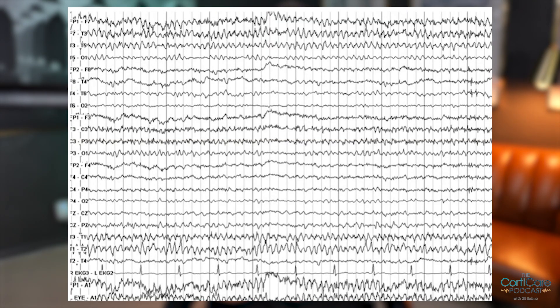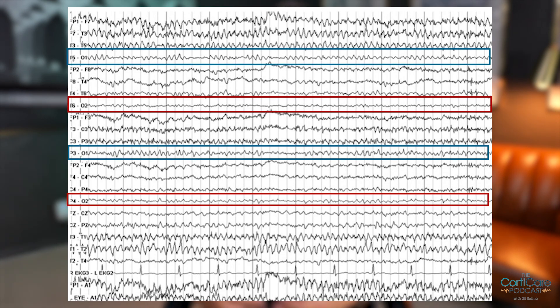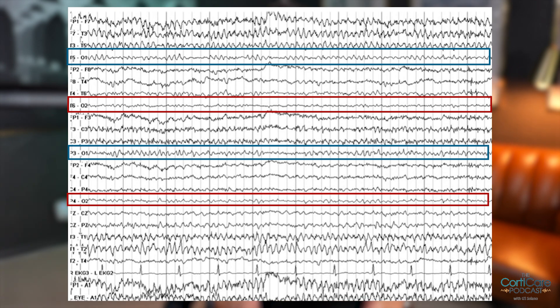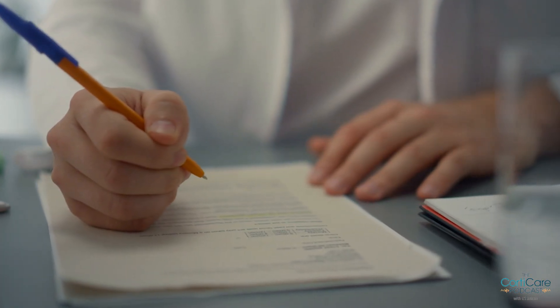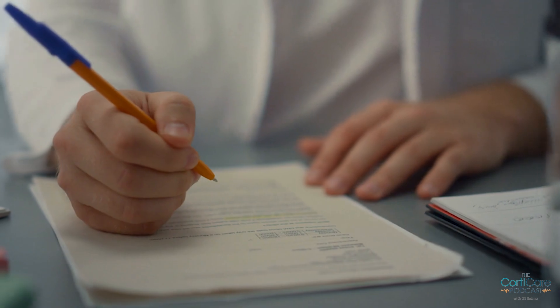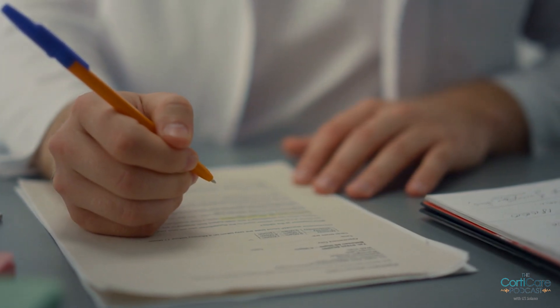Here's an example of alpha asymmetry where the rhythm is slower over the right hemisphere in a patient who has suffered from an acute right frontoparietal ischemic infarction. This type of alpha asymmetry can be a crucial clue in diagnosing the underlying condition.